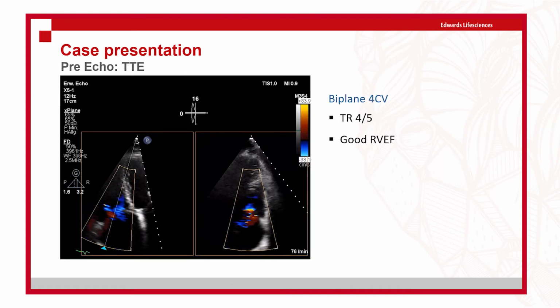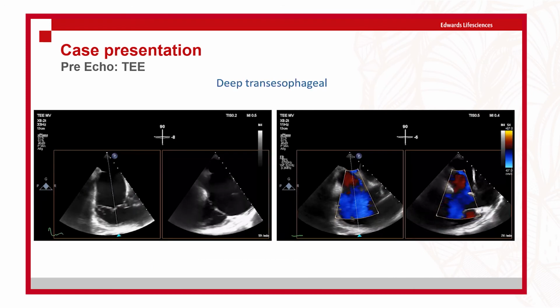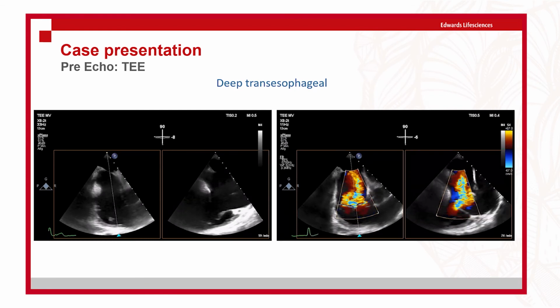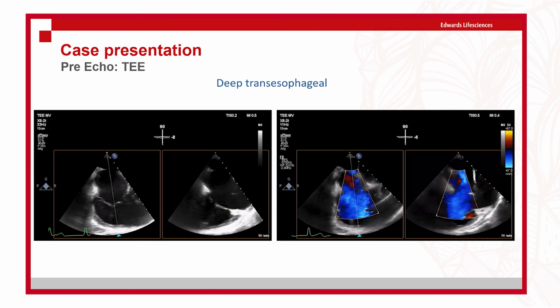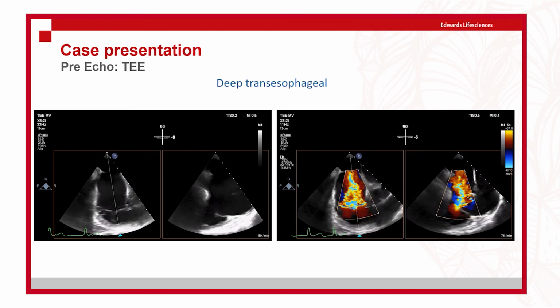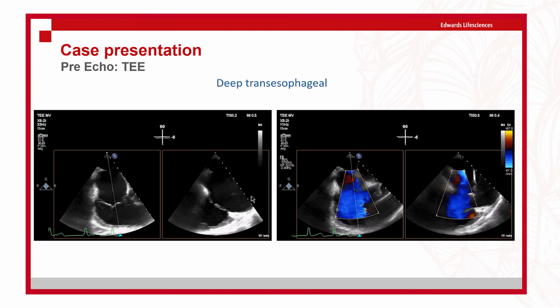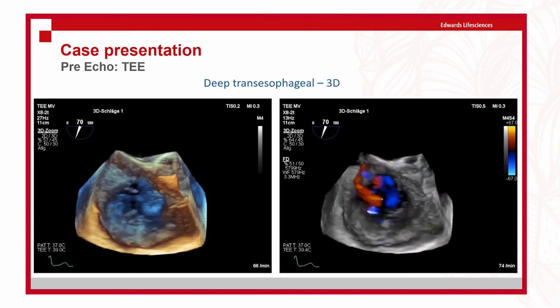You see the initial images, and it's very interesting to see what you see in transthoracic echocardiography. If you look into TOE on the day of the procedure, you can appreciate that the same regurgitation can appear quite massive on TOE, as you see here, with a typical gap in the leaflets. But also here, this is a massive dilatation of the right atrium with a preserved right ventricular function, and these patients do have a benefit.